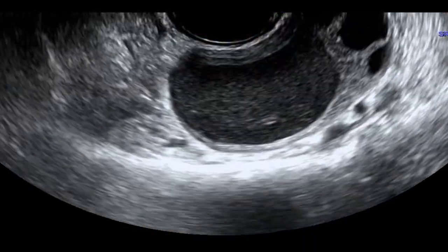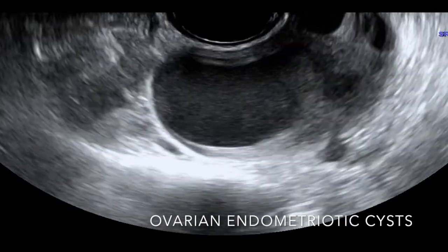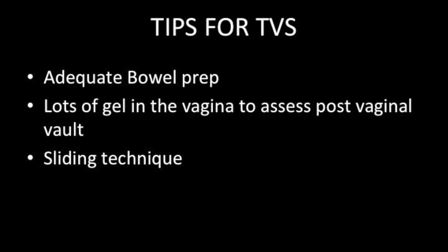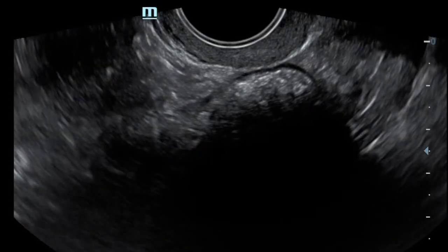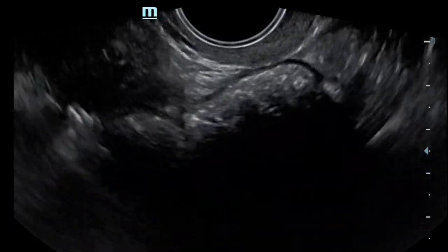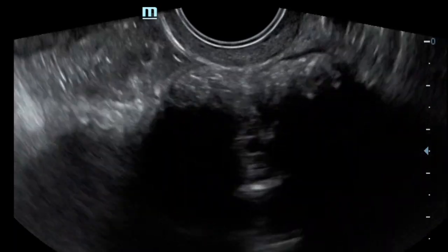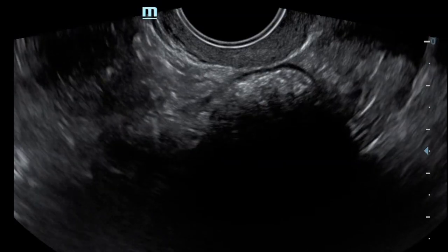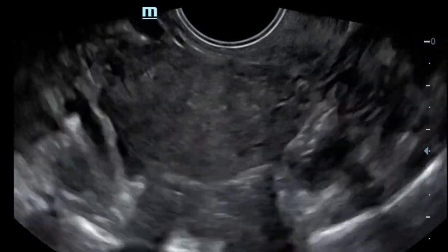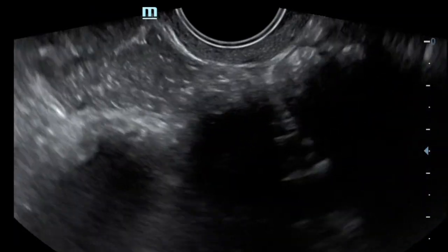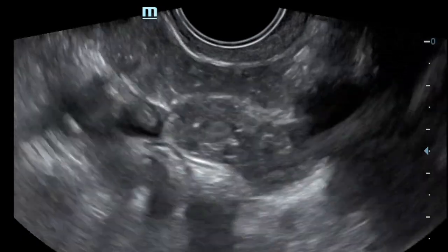As we do scans normally we see endometriotic cysts that we label, measure, and compare with previous scans. But while doing the transvaginal scan we need to learn a few tricks. The first is adequate bowel preparation. Patients usually walk in directly for a transvaginal scan with no preparation, but when we get a picture with fecal shadow obscuring the left adnexa and ovary, the examination will be suboptimal. In this case, it is better to reschedule the patient the next day with adequate bowel preparation, ensuring the rectum and rectosigmoid are collapsed and flat with the wall clearly visible.